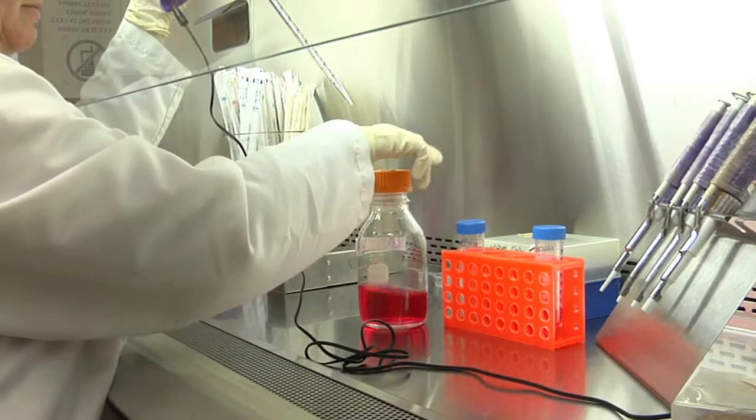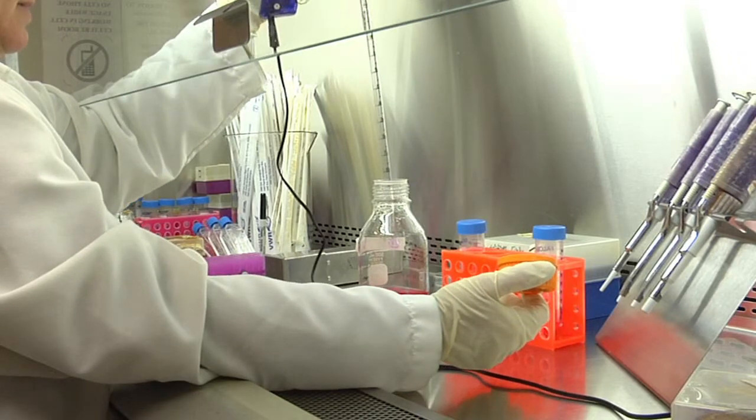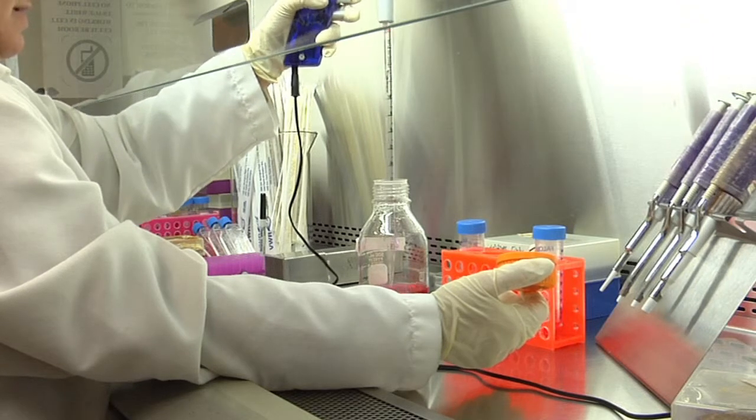The main bottle of medium is the most critical container. If it becomes contaminated, every single cell culture will be contaminated during new cell seeding as well as during times when medium is changed in the culture vessels. As always, make sure that the end part of the pipette, where the tip is, never comes in contact with the neck area of the bottle or the top of the container. Go straight down the bottle with the pipette.